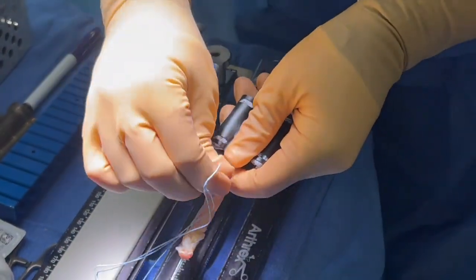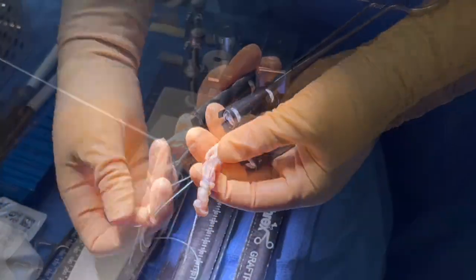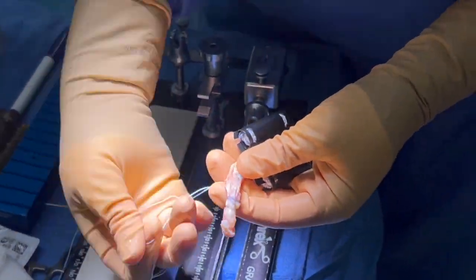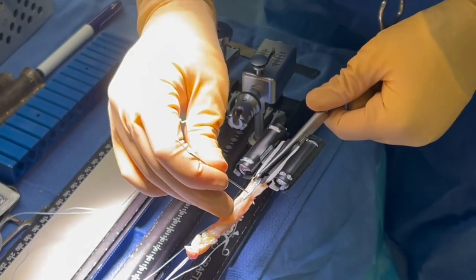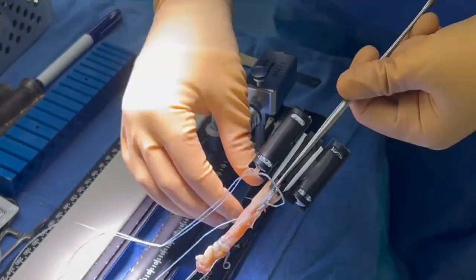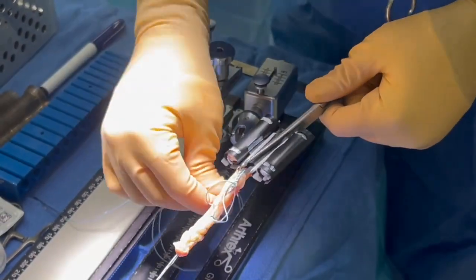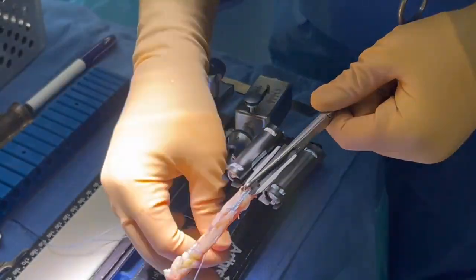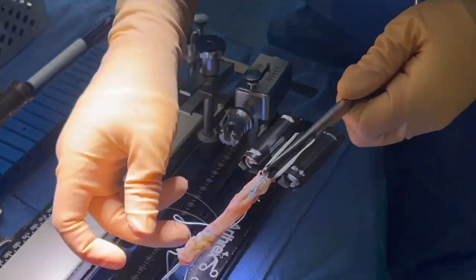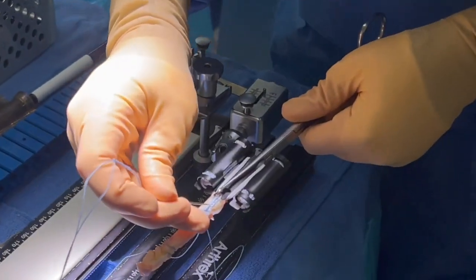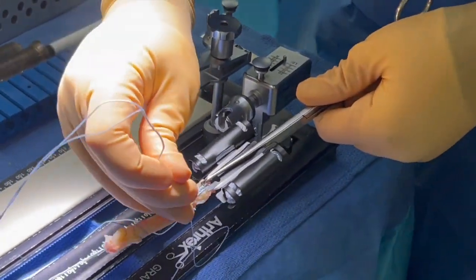You can see here we use the standard Arthrex clamp. We're passing the fiber tape through the quad and then you want repetitive passes through the quad to integrate the tape device in the quad tendon. This is the highest biomechanical strength of any of the quad devices currently out.